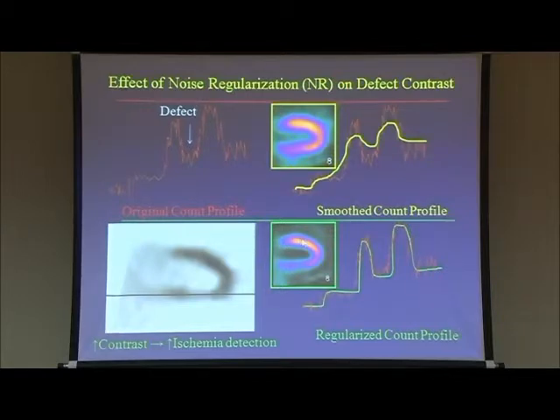So guess what? We get the smooth response, but we keep the contrast. And you see the contrast here compared to this. This is the same patient, and the contrast here in the chamber compared to that. Oh, and yes, by the way, this was 12 minutes, this was 2 minutes. Okay?